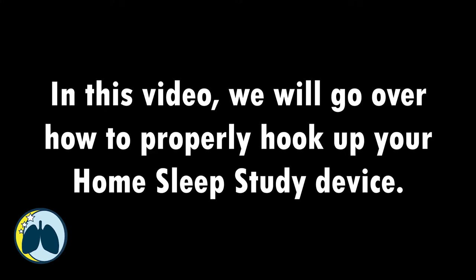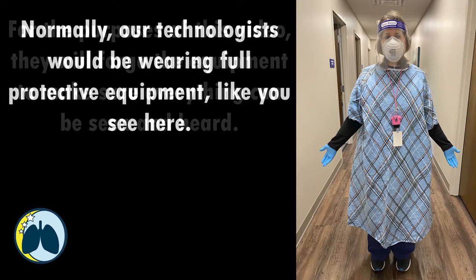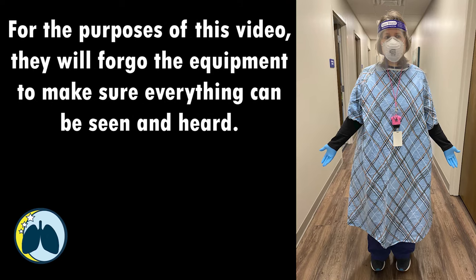In this video we will go over how to properly hook up your home sleep study device. Normally our technologists would be wearing full protective equipment like you see here, but for the purposes of this video they will forgo the equipment and make sure everything can be seen and heard.